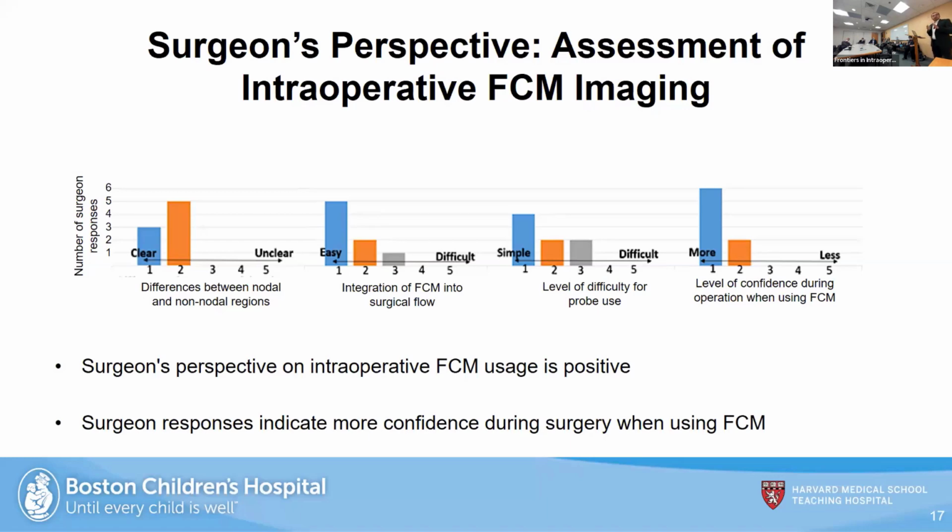The perspective in general was that FCM use was positive, and more importantly, the surgeons' responses indicated more confidence in using FCM during the surgery. A small training curve was found in terms of using the probe, but I think this can be addressed by giving the surgeons more training preoperatively, or even before using these.